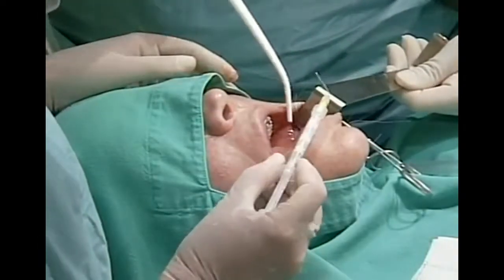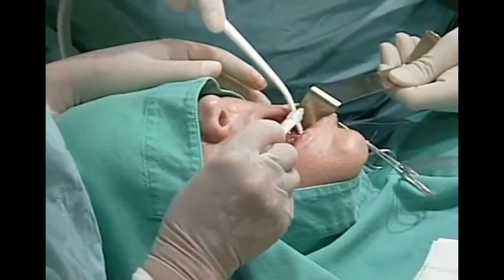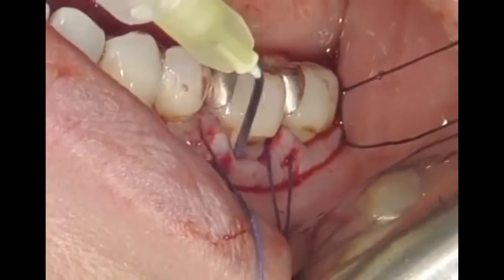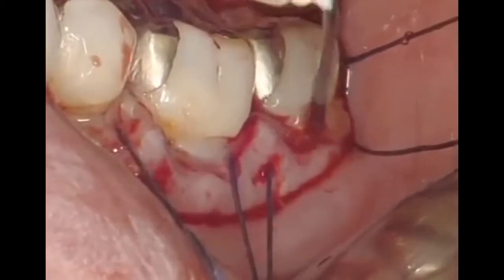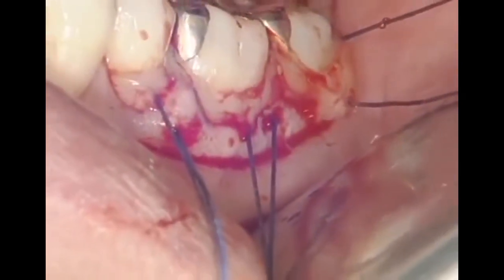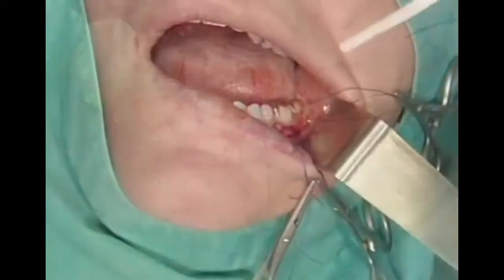PrefGel is applied now. The needle is inserted directly into the defect. The PrefGel is then left in the defect for 2 minutes to remove the smear layer by conditioning the root surface. Excess PrefGel flows out at the edge of the gingiva. The same procedure is applied to the lingual aspect.